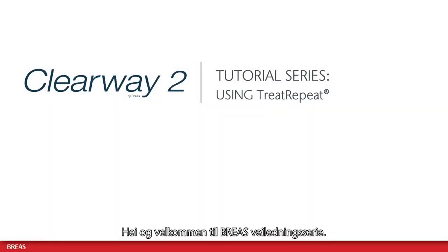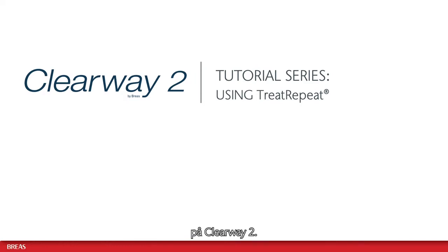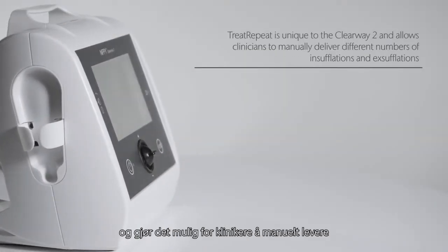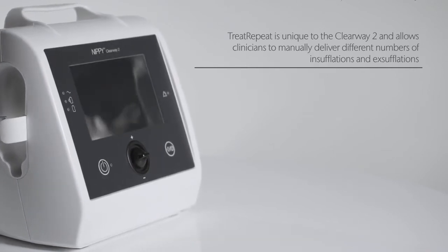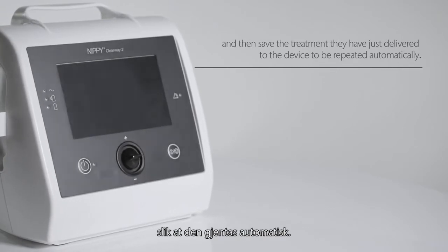Hello and welcome to the Breas tutorial series. In this video I will show you how to use the Treat Repeat feature on the Clearway 2. Treat Repeat is unique to the Clearway 2 and allows clinicians to manually deliver different numbers of insufflations and exufflations, and then save the treatment they have just delivered to the device to be repeated automatically.